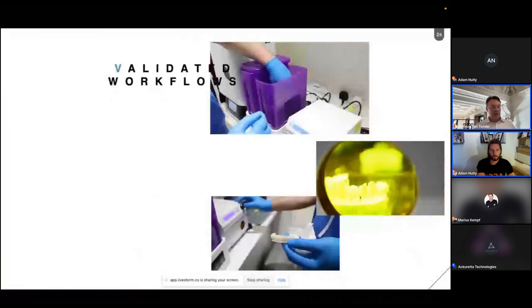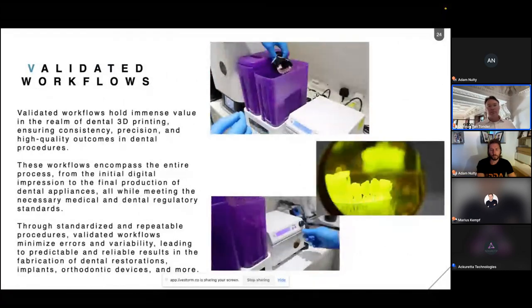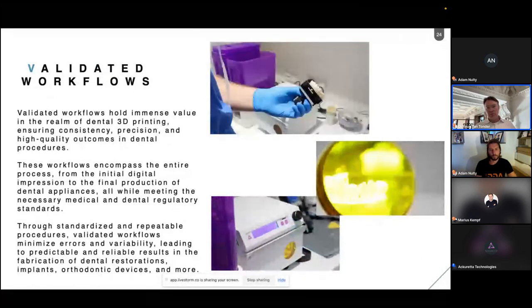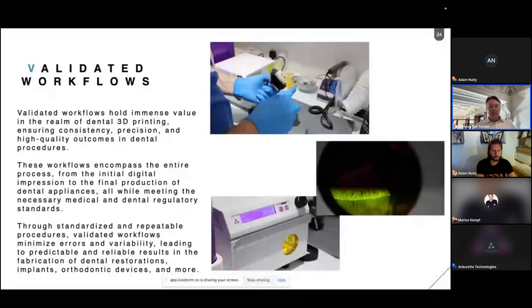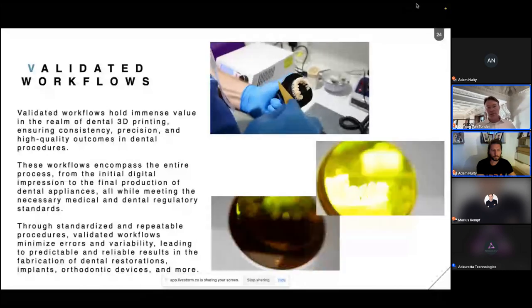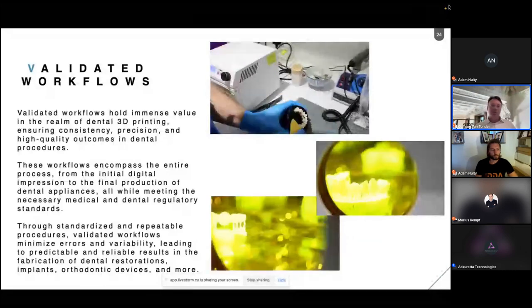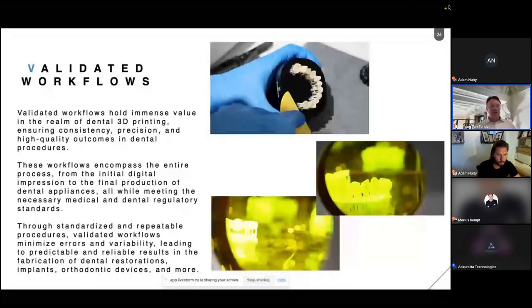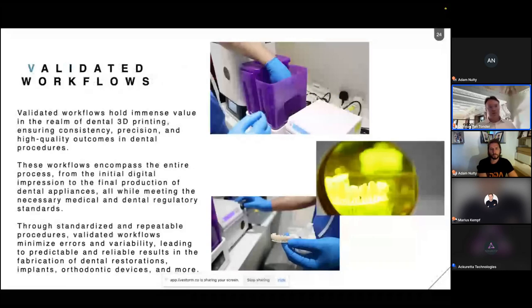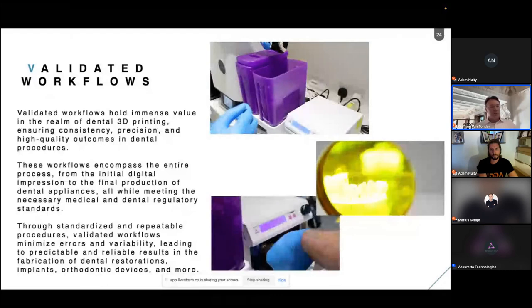So if we talk about validated workflows, Adam alluded to this earlier, your validated workflows, especially for intraoral devices, are really, really important. It doesn't only encompass the actual 3D printing, but also the post-processing, which is maybe one of the most important parts of your 3D printing intraoral devices workflow, and also that you can be repeating what you are doing. So it's repeatable, it ensures quality, it ensures patient safety.